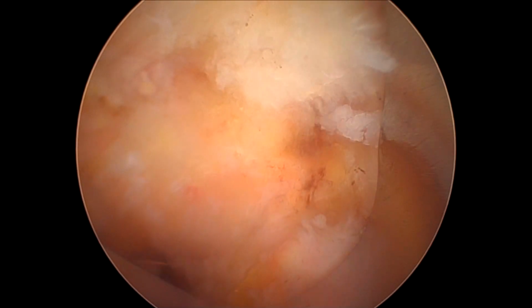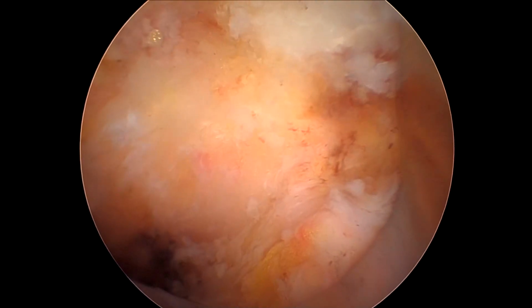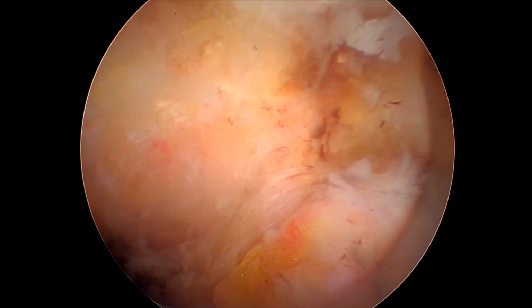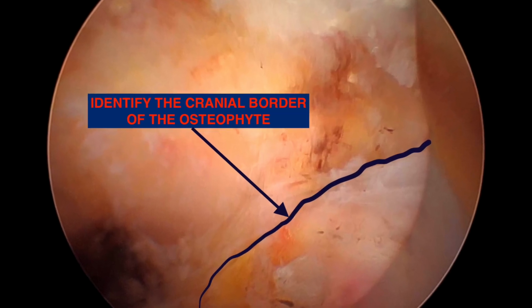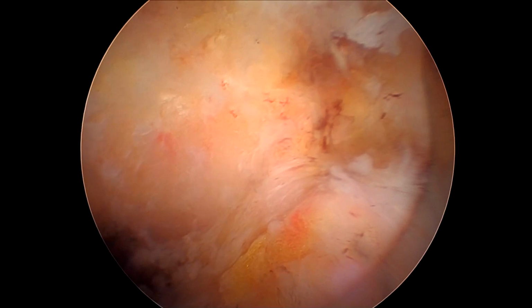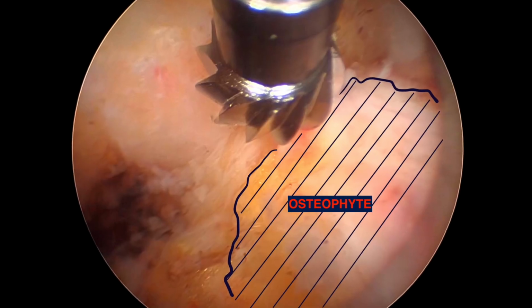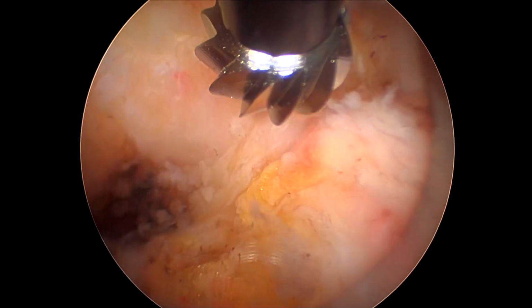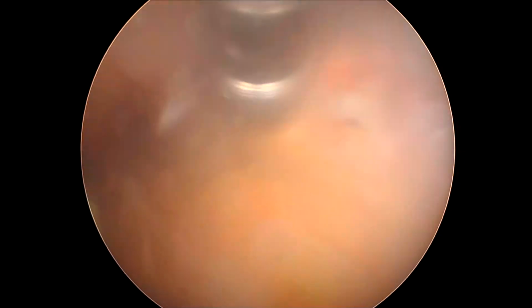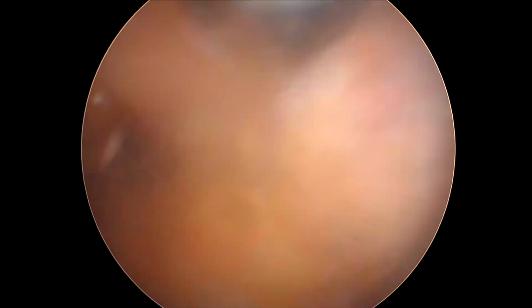The next step is to identify the upper edge of the osteophytes, as you can see on the right side, and then we start drilling. We use a drill, but when drilling, you have to try to preserve the cortical surface of the lamina. We are going to drill in the direction of the inferior articular process all the way down until we see the tip of the joint.